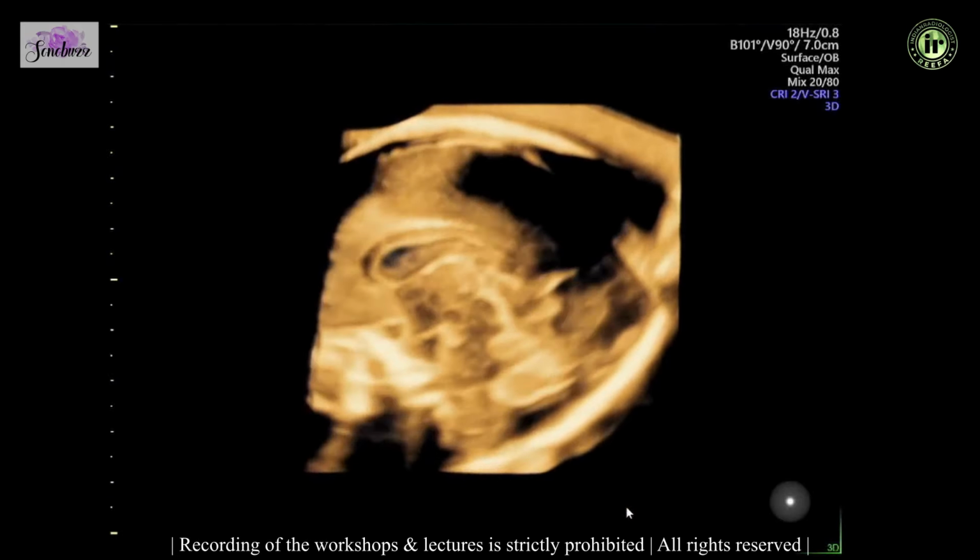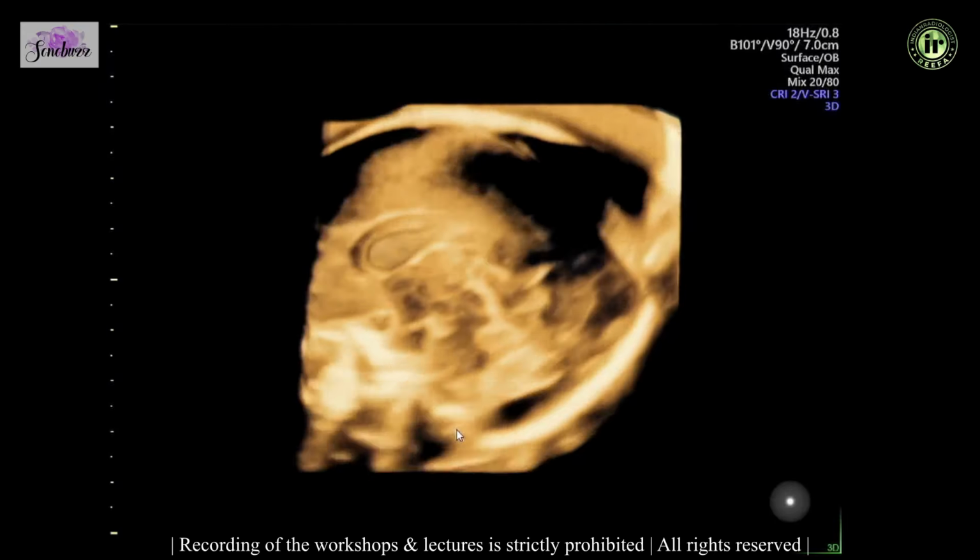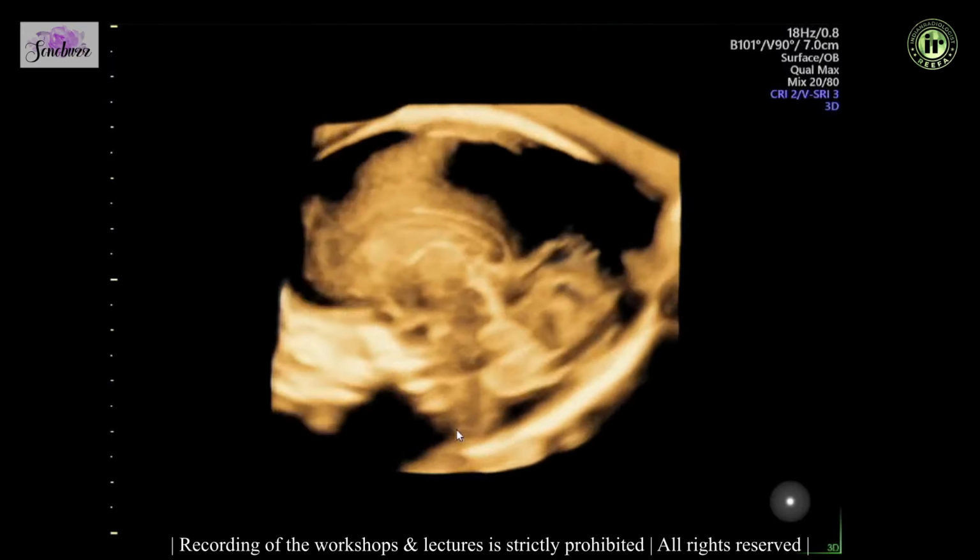orientation. You can see the fourth ventricle, the fastigium, the hemisphere, the different fissures of the cerebellum, the tectal plate, the cavum septum, and that again is the hindbrain, the midbrain, pons, and medulla oblongata. And of course we can angulate a bit.